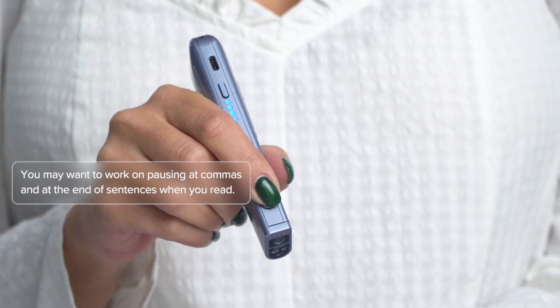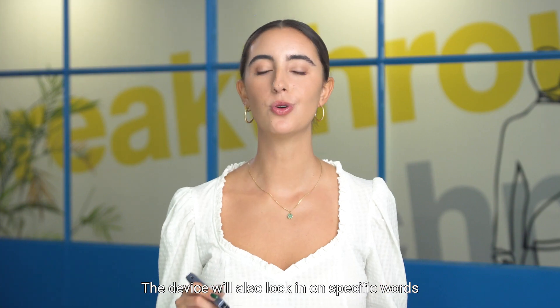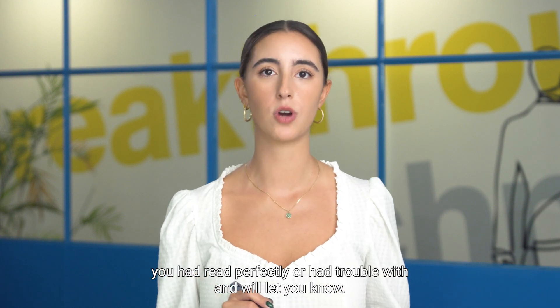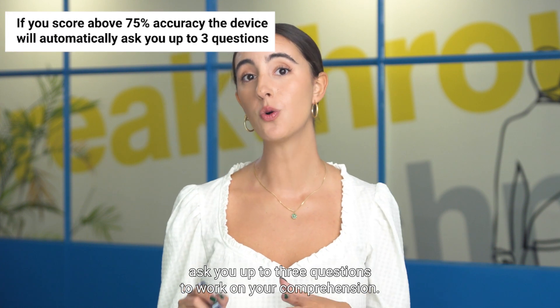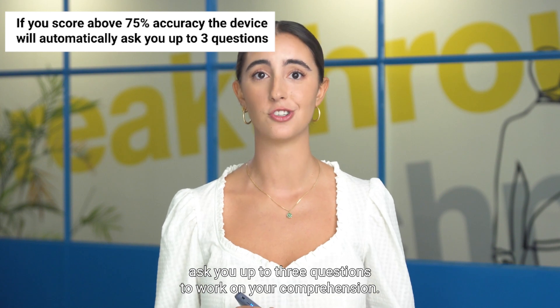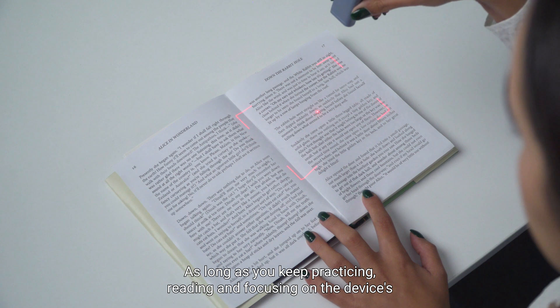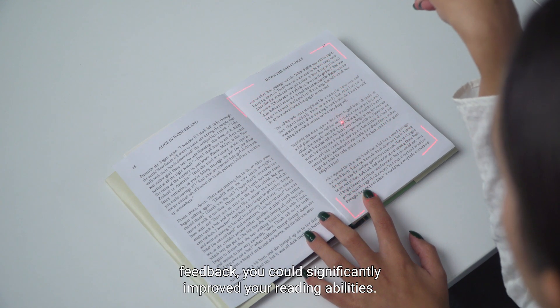You did it. Thank you for practicing your reading. You may want to work on pausing at commas and at the end of sentences when you read. The device will also lock in on specific words you read perfectly or had trouble with, and will let you know. If you score above 75%, the device will also ask you up to three questions to work on your comprehension.